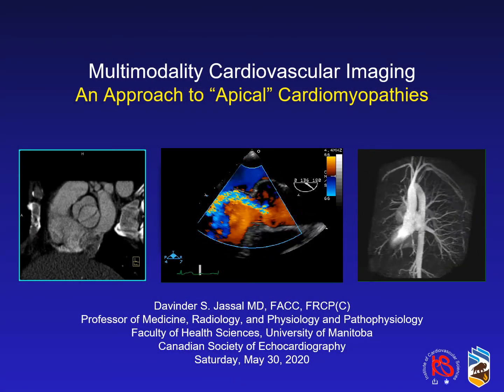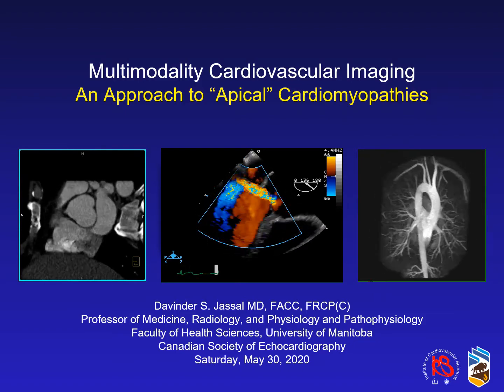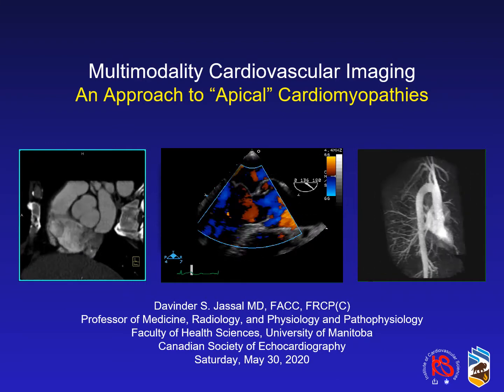Over the next 20 minutes, we're going to focus on the role of multimodality cardiovascular imaging, in particular, the complementary roles of echocardiography, cardiac CT, and cardiac MRI in the non-invasive diagnosis of apical cardiomyopathies.